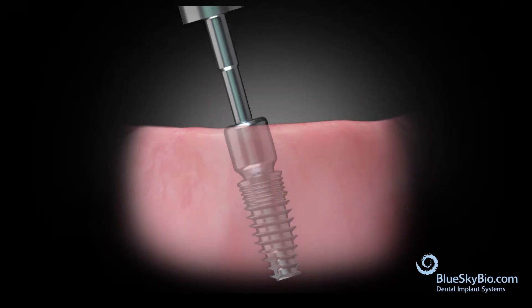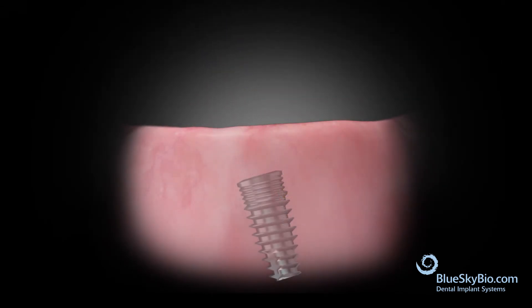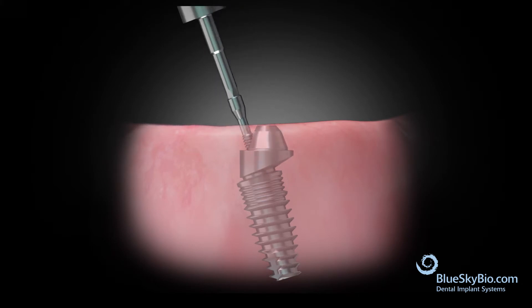Remove the healing abutment on the angled implant. Orient the multi-unit abutment so that the top platform comes into parallel with the other implants, and then torque to 30 N·cm.